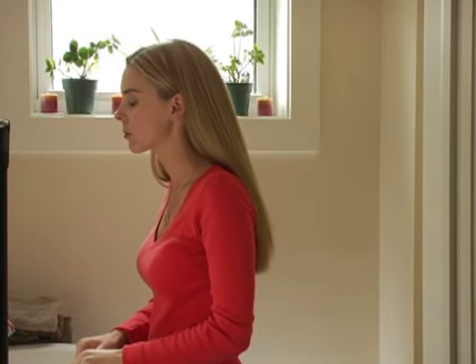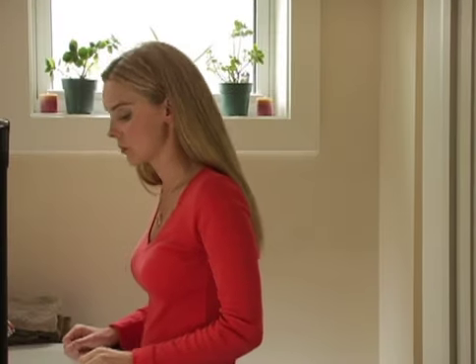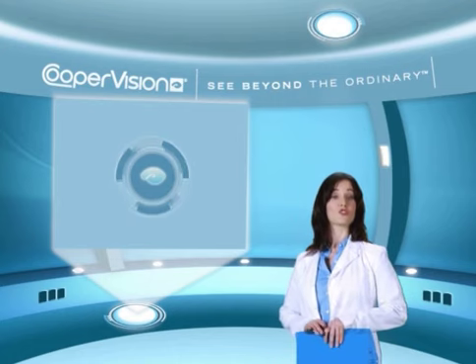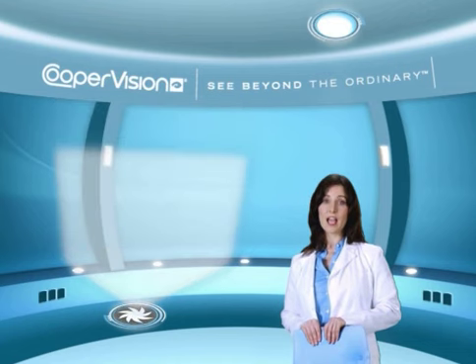Once you've finished properly inserting your contact lens in your right eye, cover your left eye and look at a distant object to see whether your lens is in place and you can see properly. If you can, then continue with inserting the other contact lens and check again to see whether it is in place and you can see properly. If you blink and the lens does not fall into place, causing blurring, then your lens may be inside out.